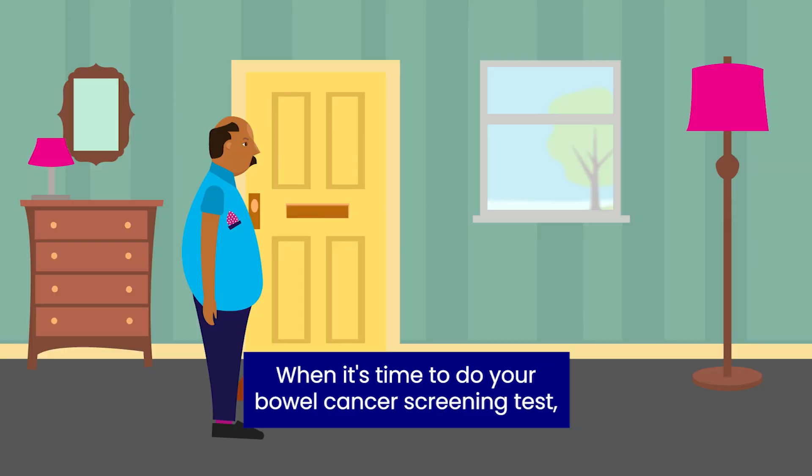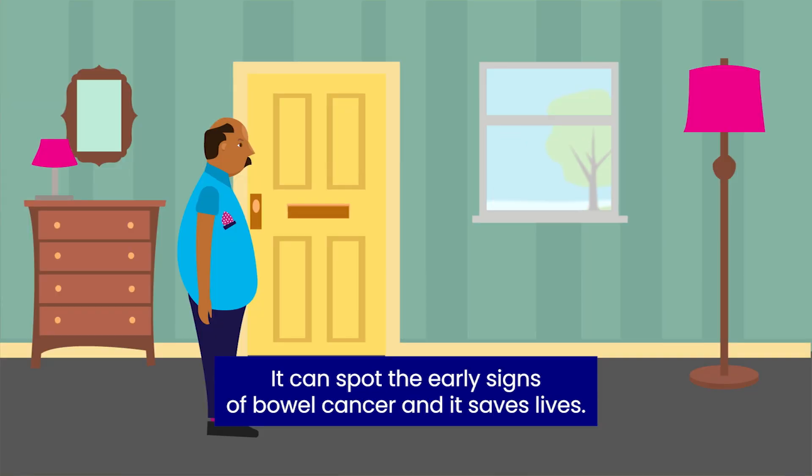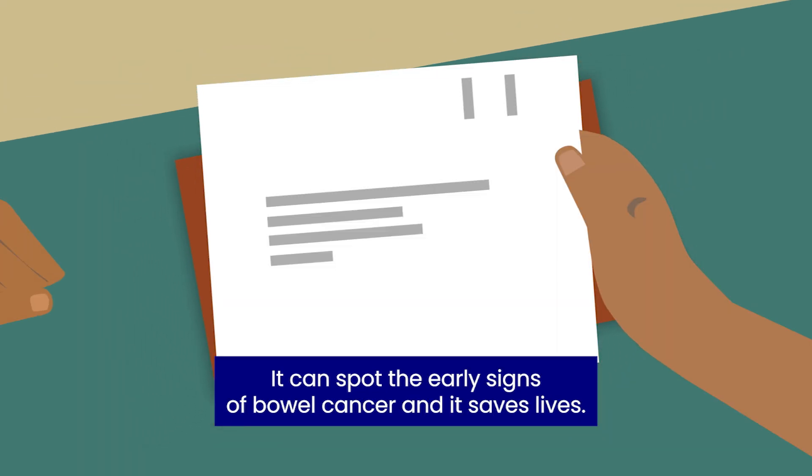When it's time to do your bowel cancer screening test, you'll get a kit through the post. It can spot the early signs of bowel cancer, and it saves lives.